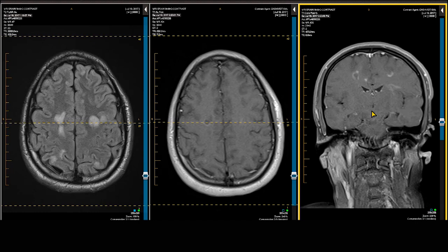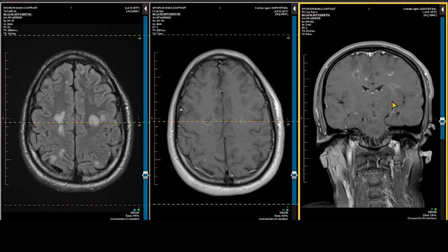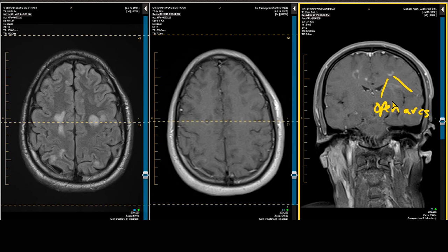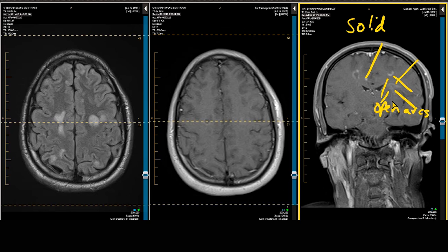Focusing on the coronal scan, it demonstrates the different types of enhancement of demyelinating plaques. You can have open arcs of enhancement, a peripheral complete rim of enhancement, and as seen in this subcortical demyelinating plaque, solid enhancement. Multiple sclerosis plaques show a wide variety of contrast-enhancing patterns, including solid nodular, peripheral complete rim, open rim enhancement, and linear enhancement.